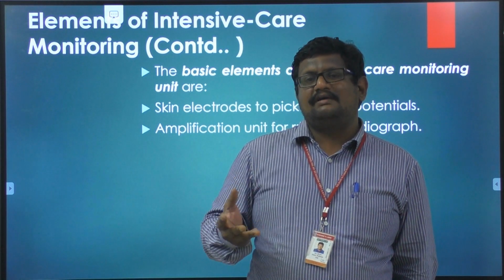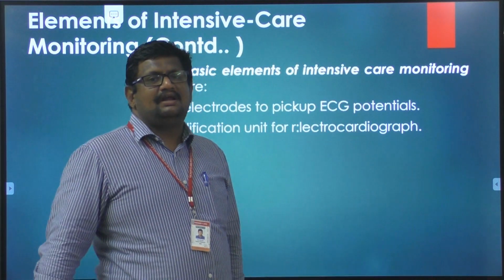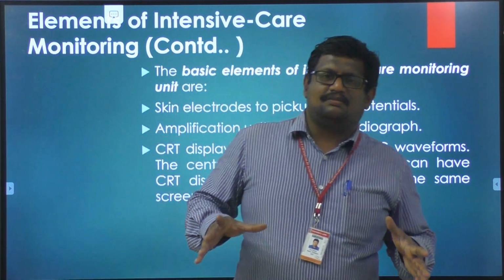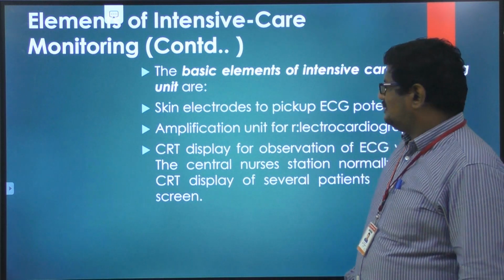That's why only then can we convert that 10 power minus 3 volts to 10 power 3 volts. So likewise, very high gain instrumentation amplifiers are required. So amplifiers are required. All these things come packed within the equipment itself. But what are all the different components in a patient monitoring system we are seeing?